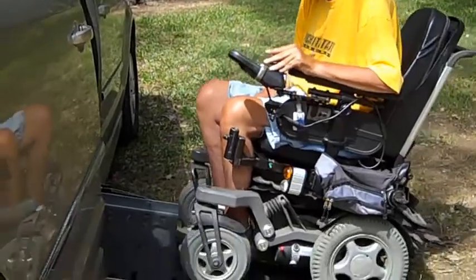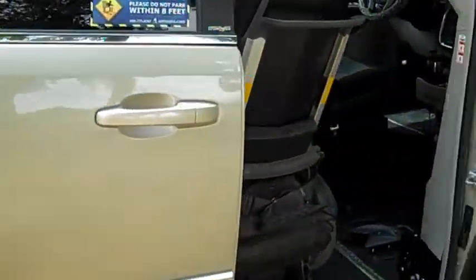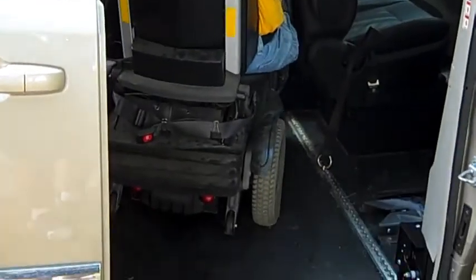Headrests and reclining backrests are nice features if you can afford them, as there are many times you might want to just lay back and rest a little bit while on your power chair. Transporting your power chair. While transporting your power chair, make sure the model you select has the appropriate and approved chair tie-downs mounted securely on the chair, and don't ever neglect using them.